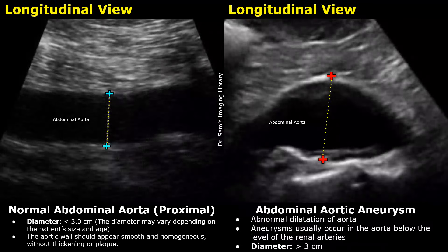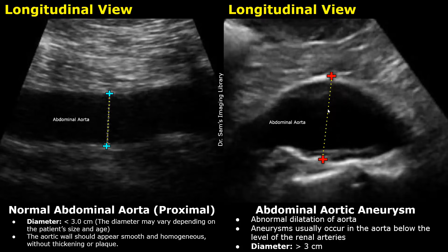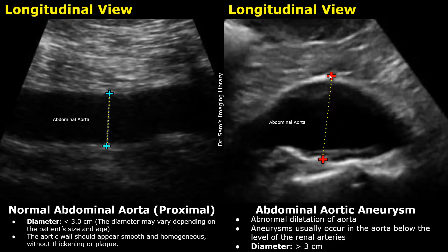Now we will compare the image of the normal aorta with its pathological appearances. Our first case is abdominal aortic aneurysm — the abnormal dilatation of the abdominal aorta. An aneurysm is commonly found below the renal arteries; the distal aorta is usually involved. On ultrasound, the diameter of the aorta will be greater than 3 cm, or 50% greater than the adjacent normal segment. In this image, you can see that the aortic diameter is enlarged, greater than 3 cm.